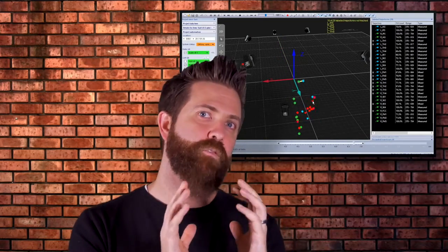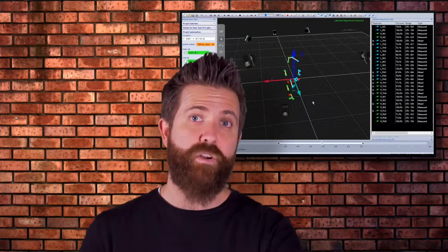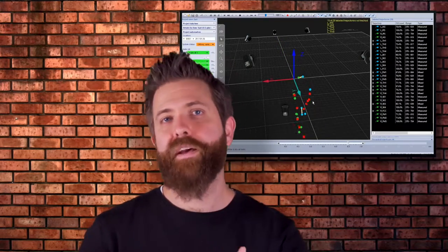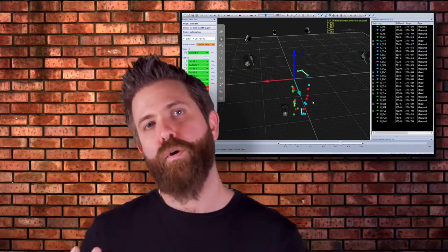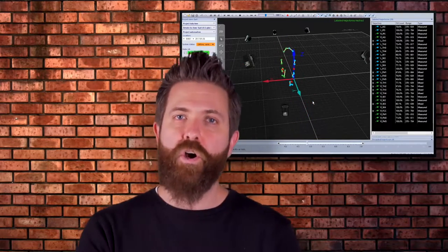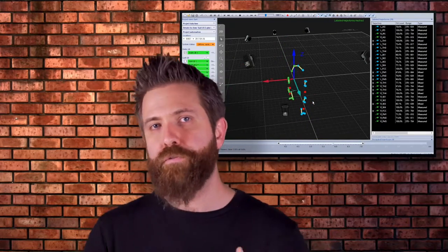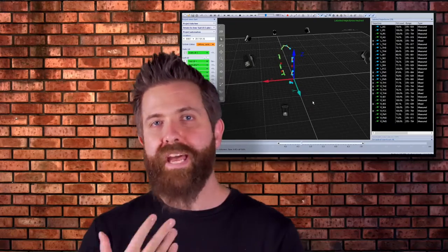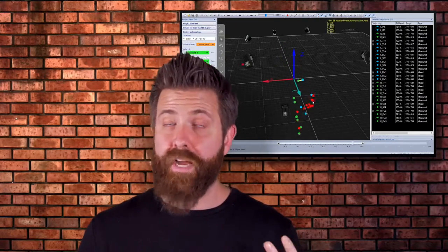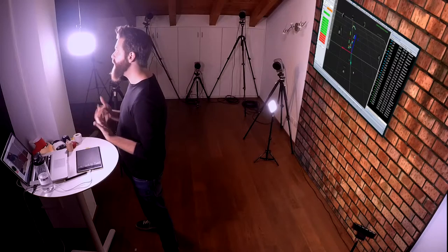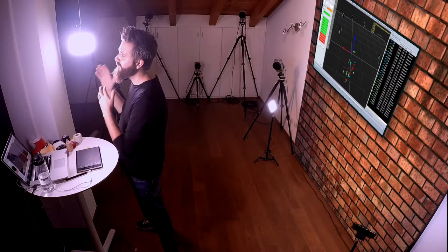That is the only area that we want to export. So as you go through an export, make sure you export enough trials from the collection. You got to make sure you have a full heel strike to heel strike on each side several times.